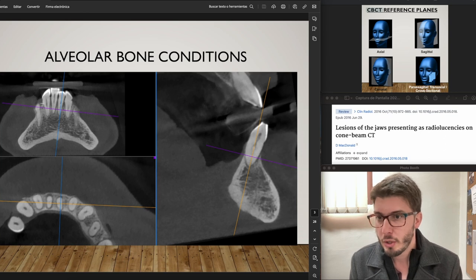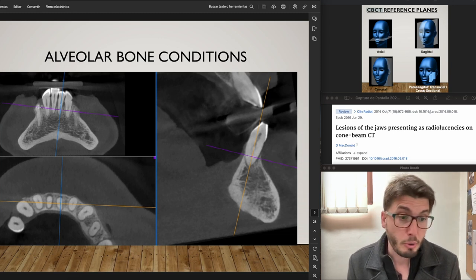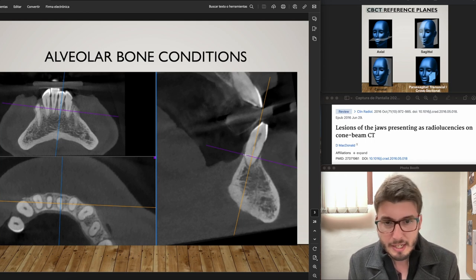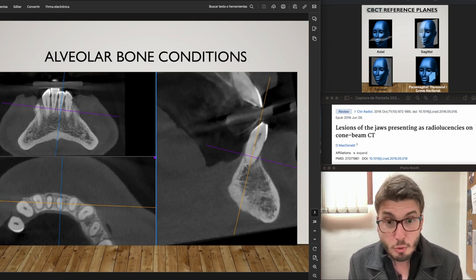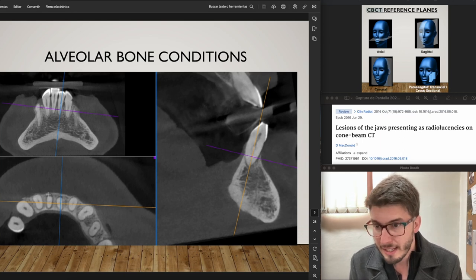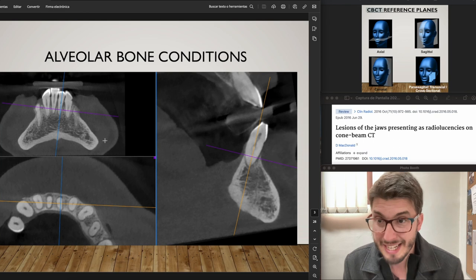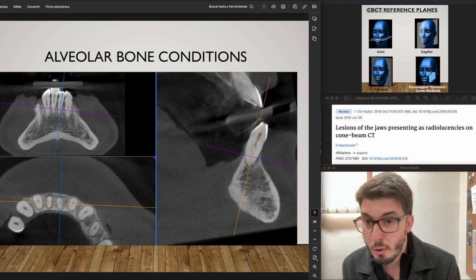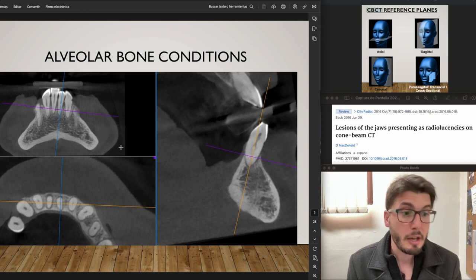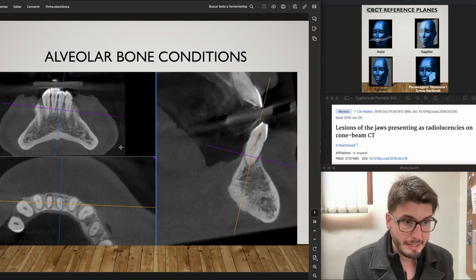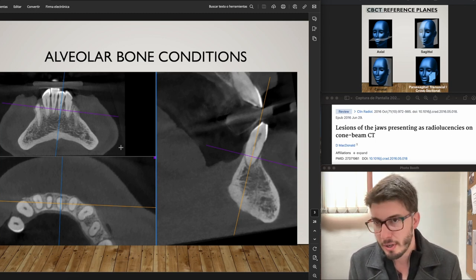We have loss of alveolar bone here — marginal bone loss of this tooth, which is horizontal bone loss of the alveolar crest, even buccal and lingual bone loss, with periodontal ligament space widening. Even in the axial plane, you can see PDL space widening at the buccal aspects of this root. Calculus shows as hyperdense images at the cervical aspects of the root or even the crown.